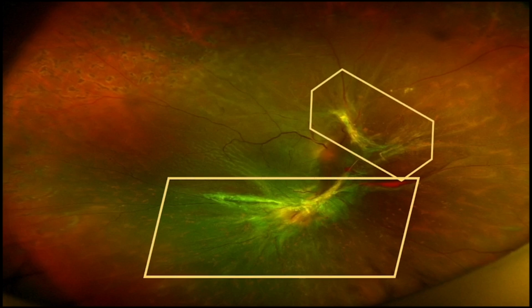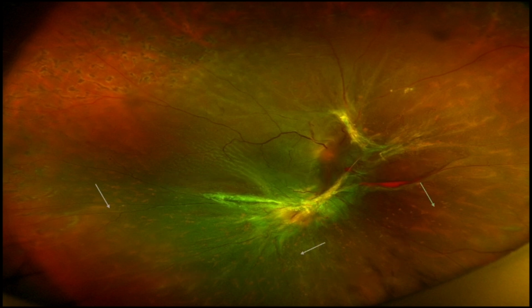The fibrovascular proliferations in the above case are firmly adherent with a poor hyaloid separation anterior to the proliferation, which can make the dissection difficult due to poor counteraction. There are also seen areas of subretinal pigment dispersion, as shown with the arrows, which eventually manifest as different grades of PVR. The star points out the area of trough, which can be used to initiate the dissection by dissecting the hyaloid face after peripheral truncation.